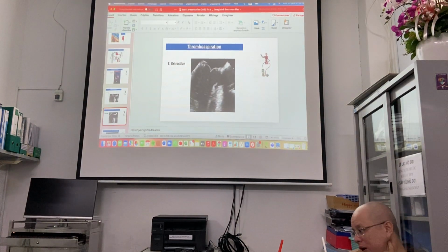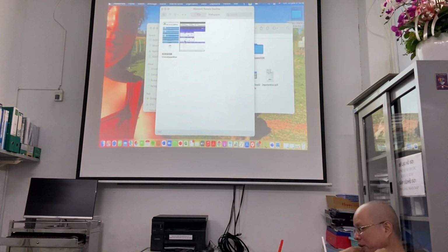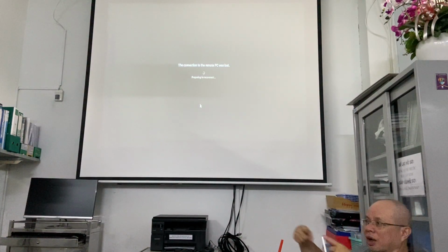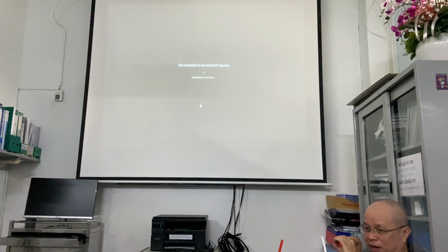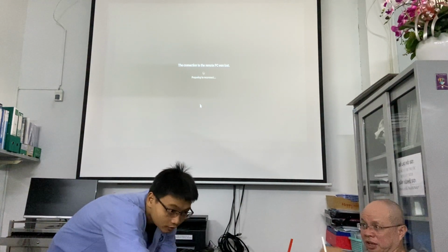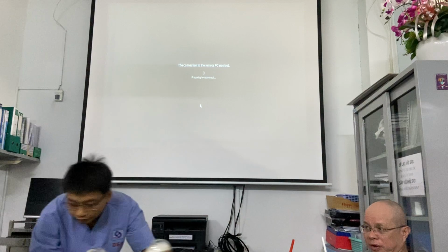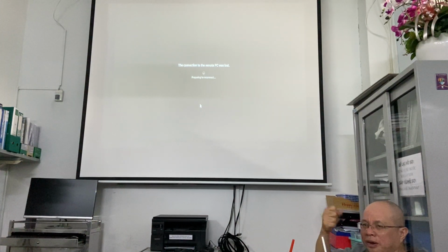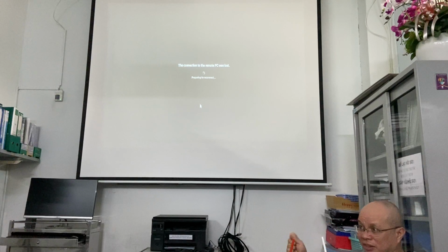The left carotid artery. You did 14 French, a 14 French sheath, from the apex across and into the left chamber, right? And under ultrasound guidance, capture.